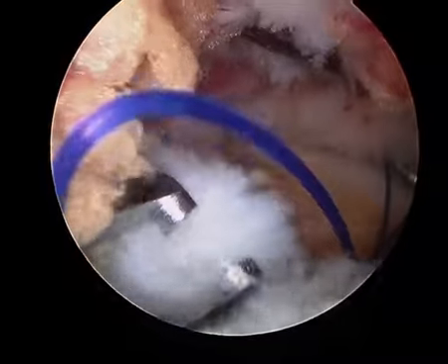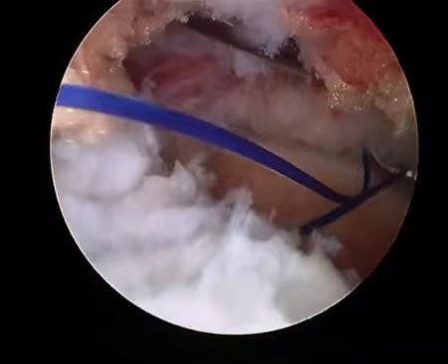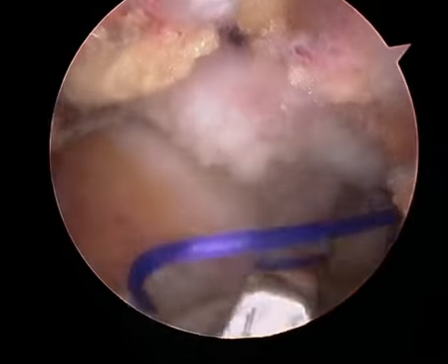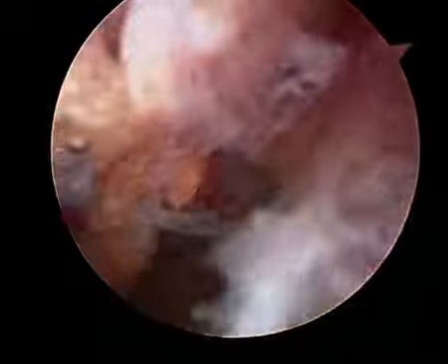Following completion of peripheral compartment procedures, the 2 traction sutures were retained. The medial ends of both traction sutures were shuttled through the corresponding medial capsule tissue using a suture passing device. The 2 ends were retrieved with a grasper and tied extracorporeally with a no-sliding knot.